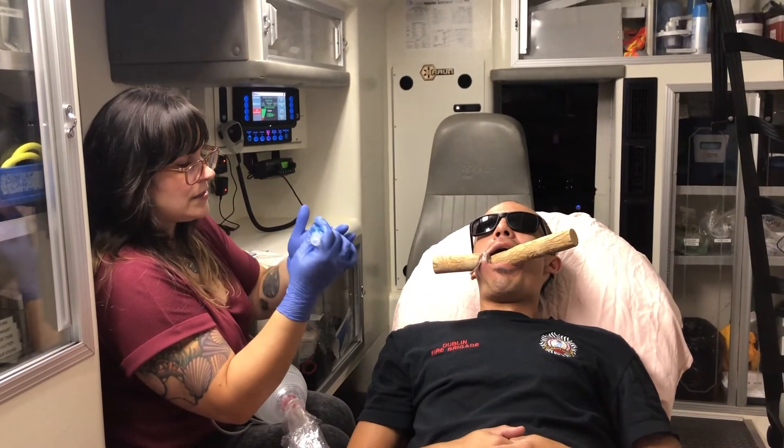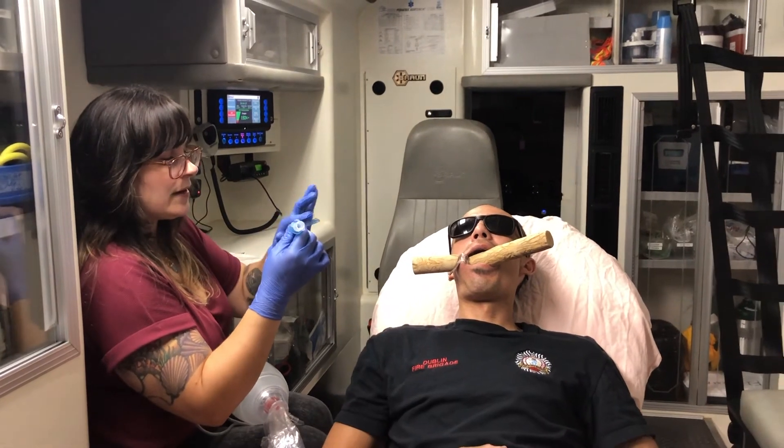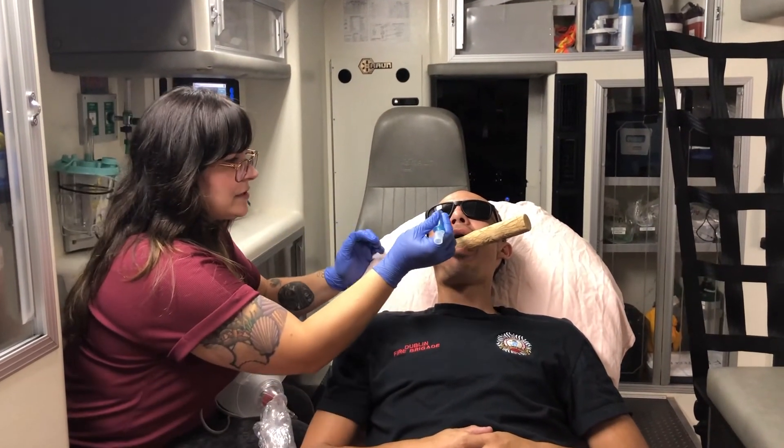Place the end of the ET tube first, because that is going to be tricky to get on and you don't want to do that once you've already put the NPA in a patient's nose.